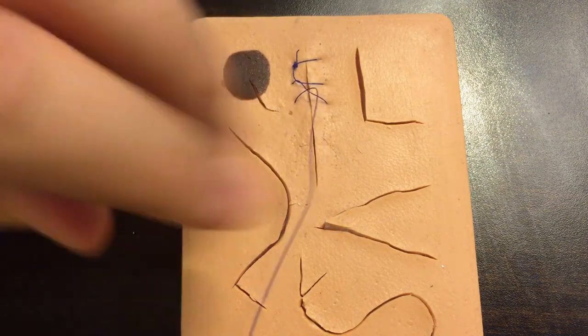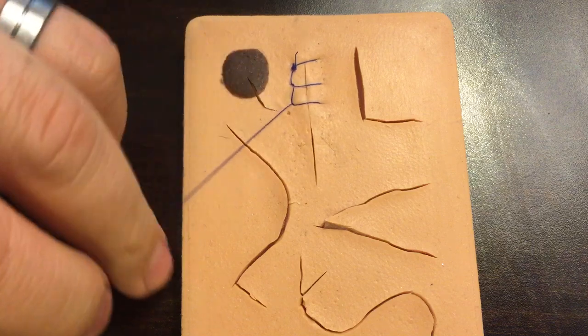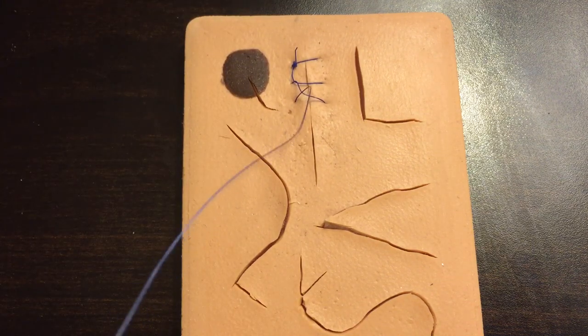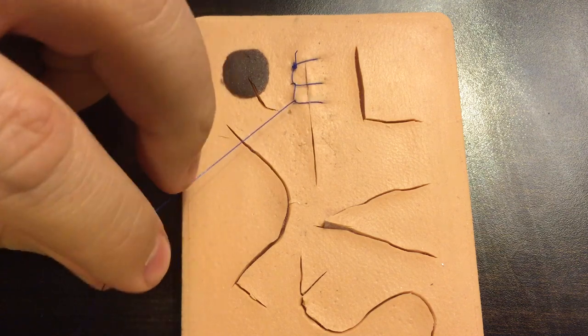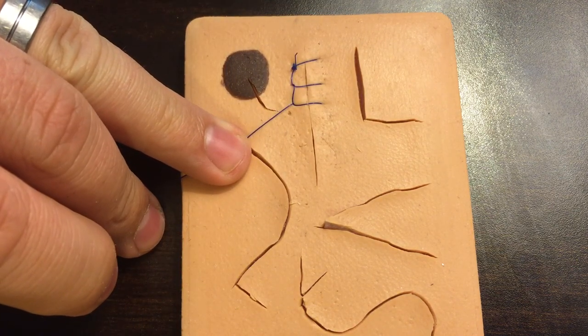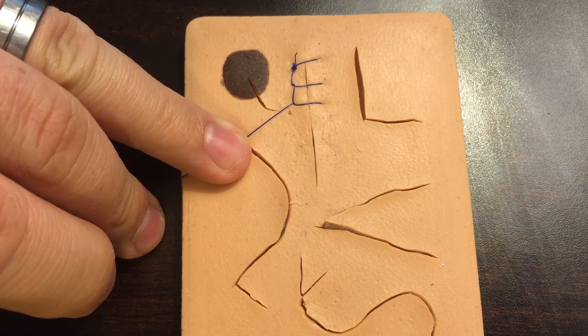Now I'm using a really big suture for the purpose of the video. This is a 3-0 proline, but if you're going to be doing a running locking like this, it's oftentimes best to do it when it's such a small, simple little laceration or incision that you're really looking for minimal scarring.